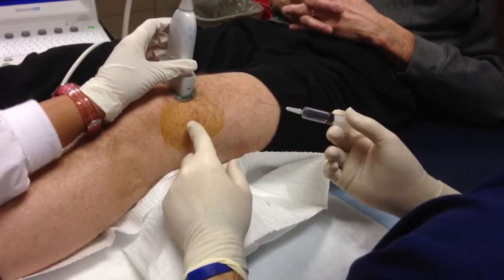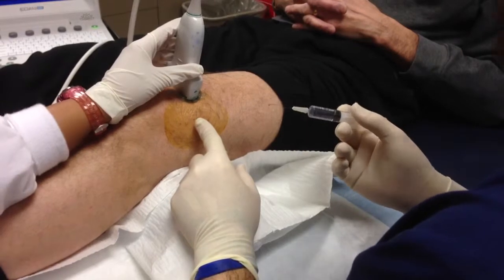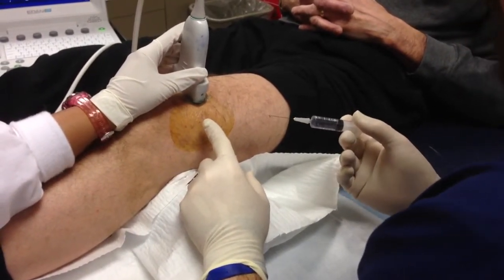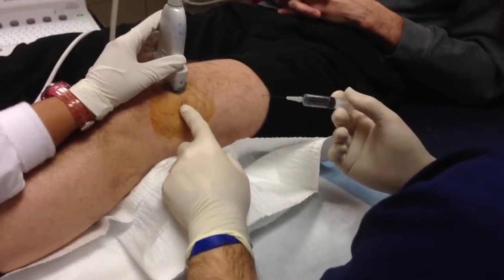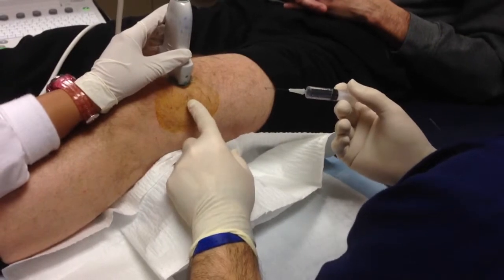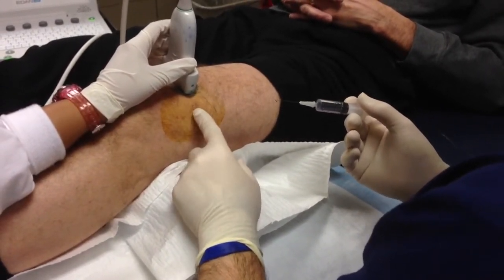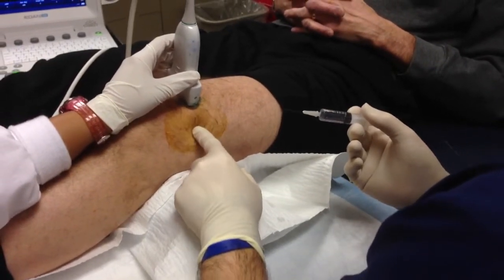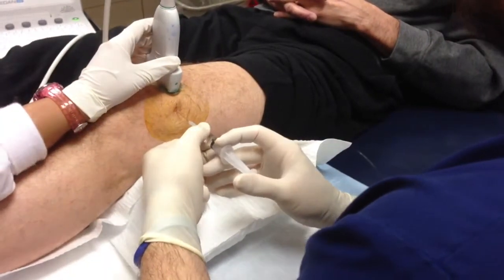Now under ultrasound we're looking in cross-section. You can see the femur down deep and a cross-section of the patellar tendon, which is kind of difficult to describe. As I push, the right side of the screen is where my entry point is — you can see the tissue deep moves, while the tissue superficial doesn't really move much. Now I'm going to go deep with the injection.